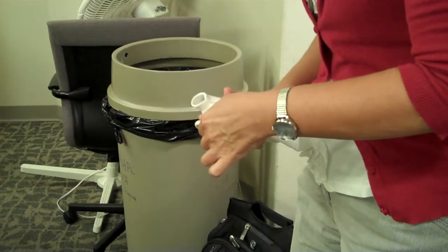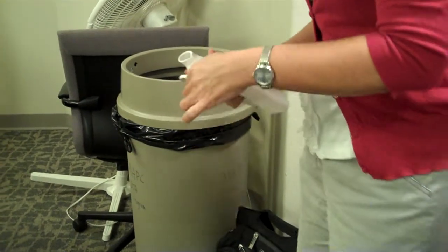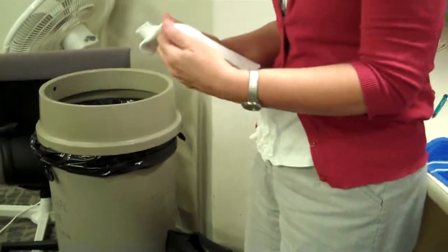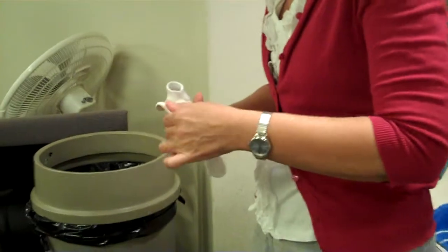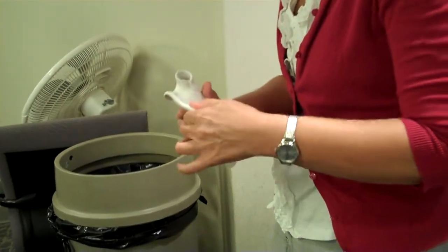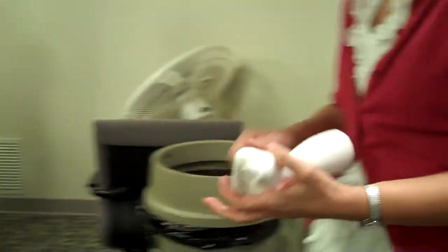So you prefer rolled rather than cut? Well, if you're a really good cutter, then go for it. I just, like I said, I always end up making a lot of more rigid areas, and you may not have the material either to roll. Yeah. And then you need to roll it over there too. Right here.